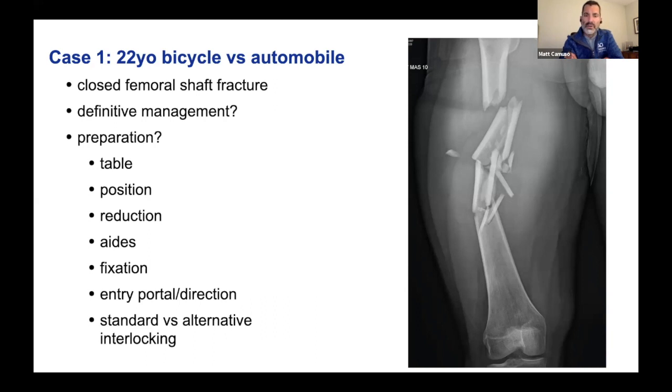And maybe Brett, while you're considering that and they're answering, maybe you can tell us what is your most important driving point out of those choices? What drives how you manage this? I think for that particular fracture, because the proximal segment is acting more like a subtroch, it would be positioning for me, because that would be something that would be a little bit not out of the ordinary, because I do a lot of lateral positioning nails for proximal femur fractures. But I have the standard kind of thing I do for reduction that I already have in mind, but for me, it'd be positioning for this one. Okay. Okay, Mitchell, how about you?